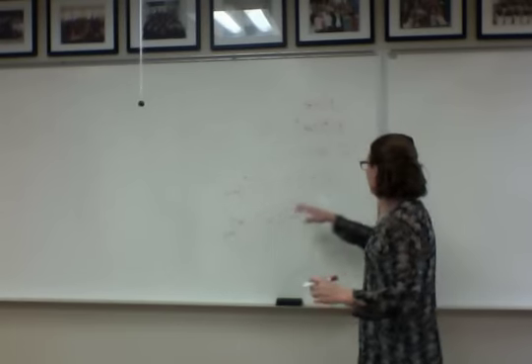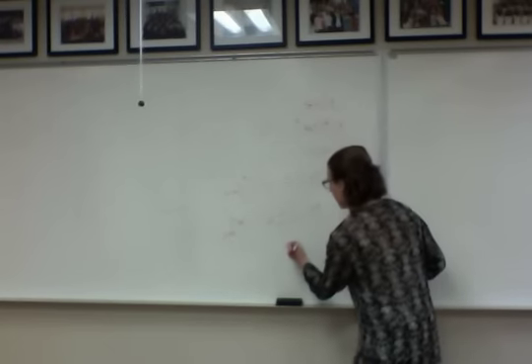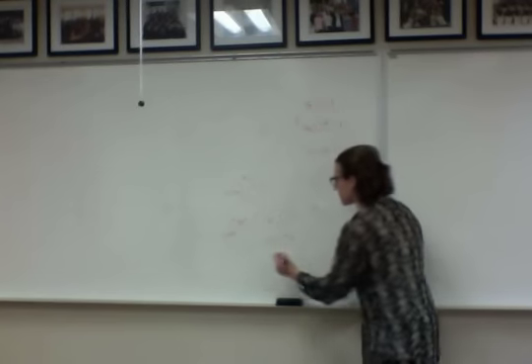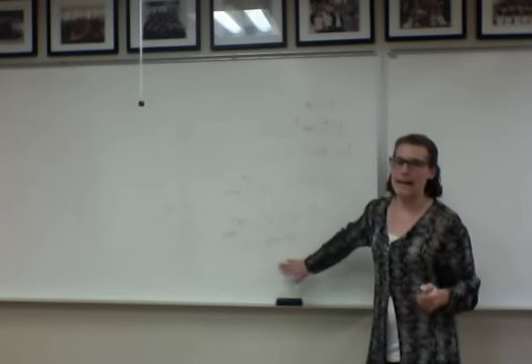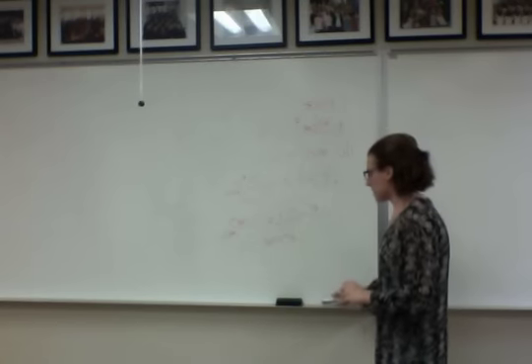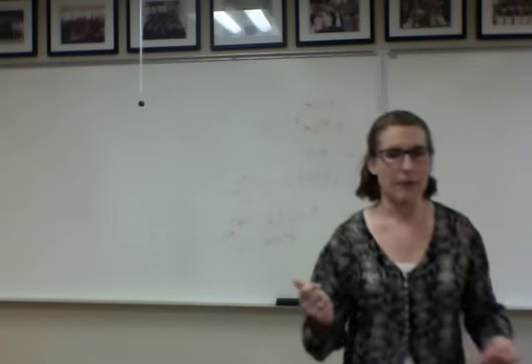And I said I'm going to treat for 10 minutes, so total I would get 0.4 degrees of tissue temperature rise, and that's within our limits for a non-thermal ultrasound. We don't want to keep this up. It's a fresh injury. So I'm going to go ahead and use those as my settings.